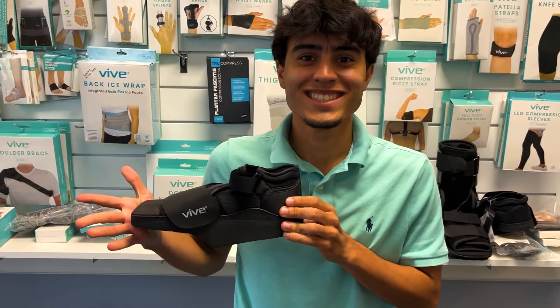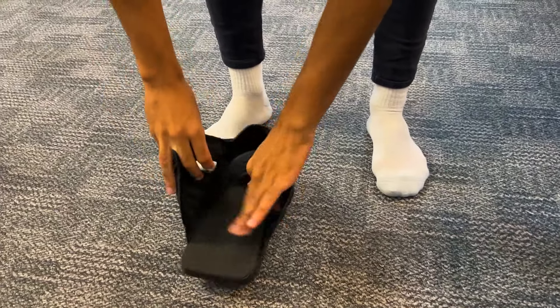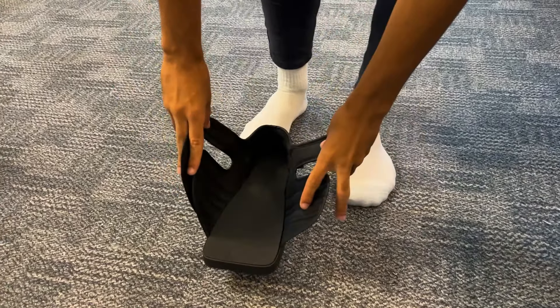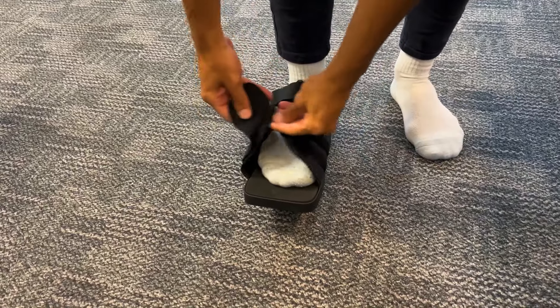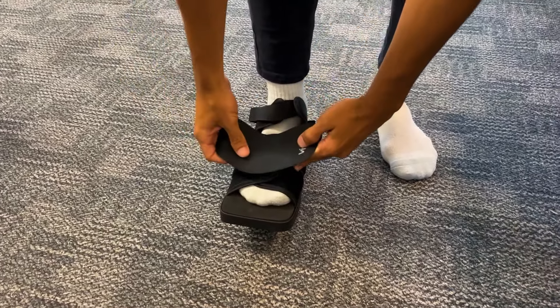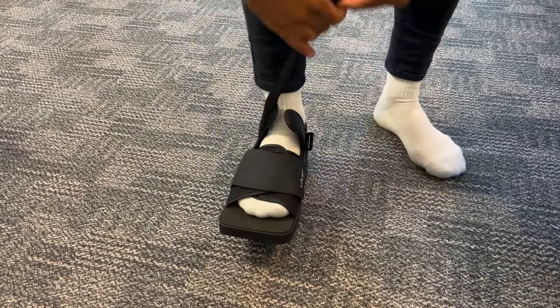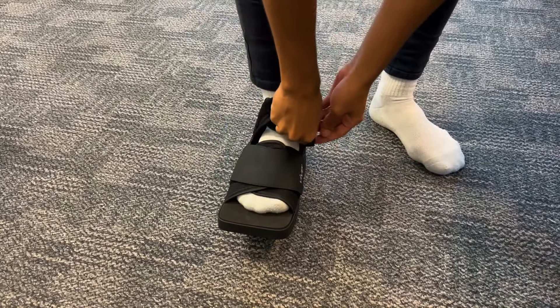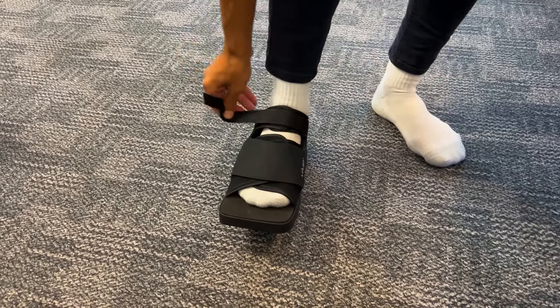This is the offloading post-op shoe. To put it on, unstrap all the straps and place your foot in the shoe. Take that part completely off to make it more secure, then velcro it in place. Next, velcro your ankle in place and trim the excess strap as needed.